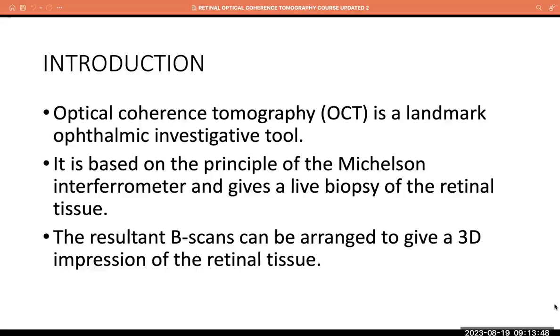One light gets to the tissue. The other is a reference beam that gets to a mirror where it is reflected back. As the light from the mirror and the light from the ocular tissue come back to the splitter, they are captured by a capturing device. The interference between the two lights is what the OCT uses to assess the density of the tissue that the laser light was pointed towards.